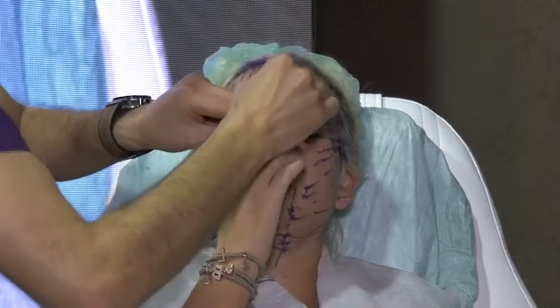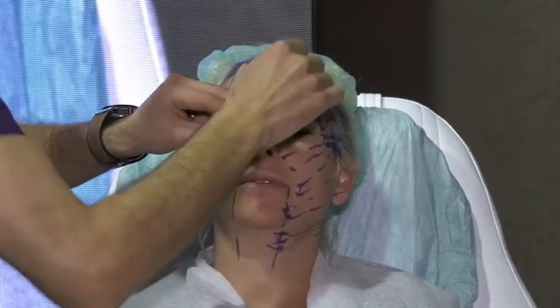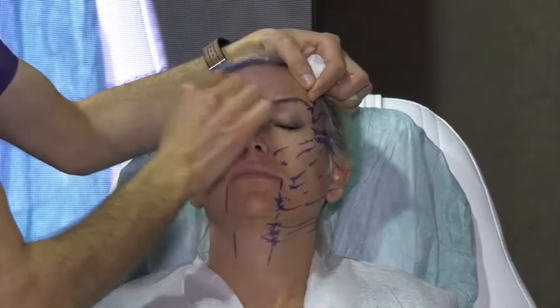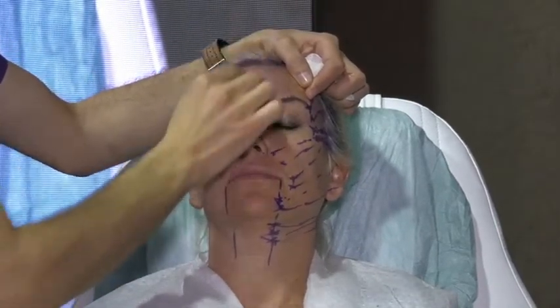If you ask for jawline, at least try to put one at the back. And then you put one at the jawline. And then you can put one under. So you have to do it. Thank you, Doctor.